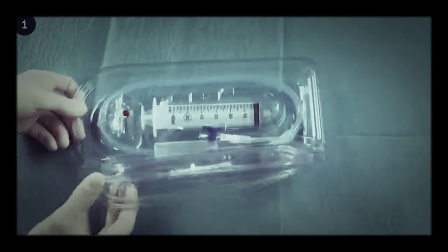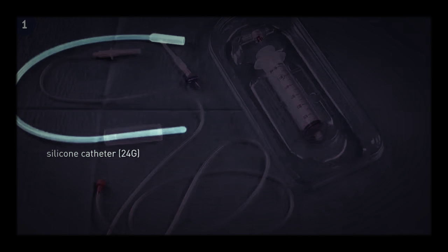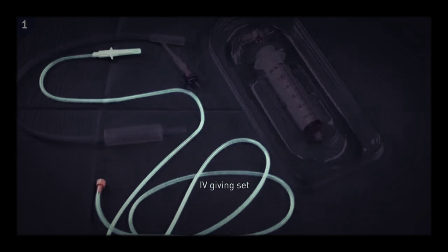The Bakri balloon consists of a silicon balloon connected to a 24 French silicon catheter, an IV giving set, and lastly a syringe.